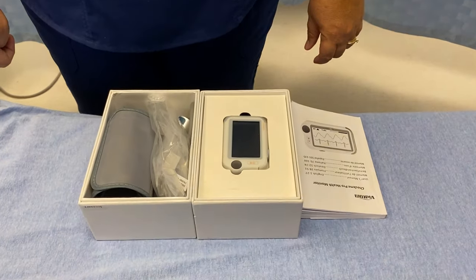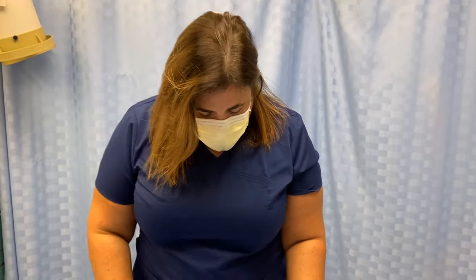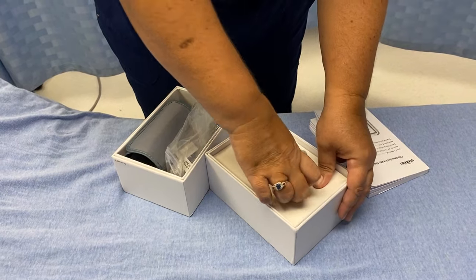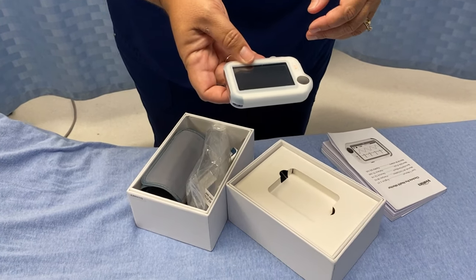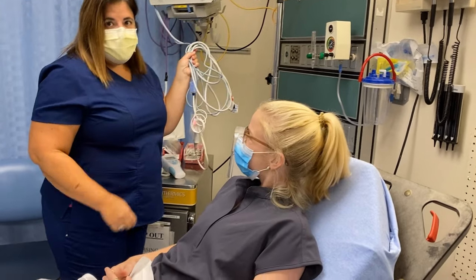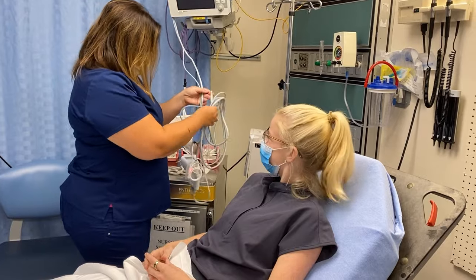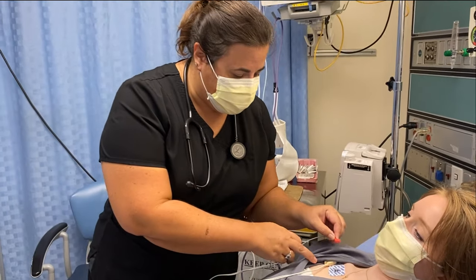What's the name of it? CheckMe Pro Doctor. Why don't we do kind of an unboxing — we've opened it up, we know what's in there, but why don't you talk about the different elements. The essence of what we're going to do today is compare this gadget with hospital equipment and see how well they line up. This is Bailey, she's a second-year med student who has graciously volunteered to be our guinea pig. And this is Noelle, a med student acting intern who wants to go into emergency medicine.